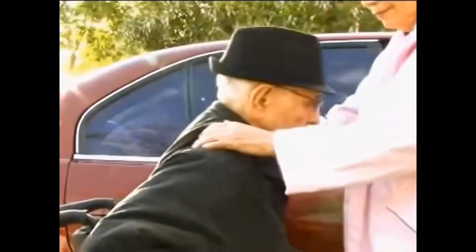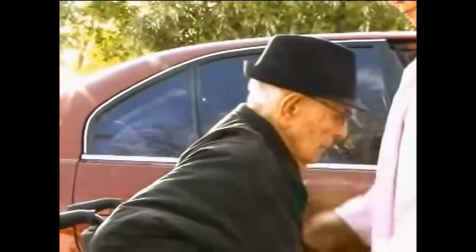Getting in and out of the car may mean working in a tight space. To give yourself more room to perform the transfer, swing the leg rests out of the way. Moving the car seat back as far as possible will also give you more room to get the individual into the car. Next, assist the person to move to the edge of the chair and lean forward.